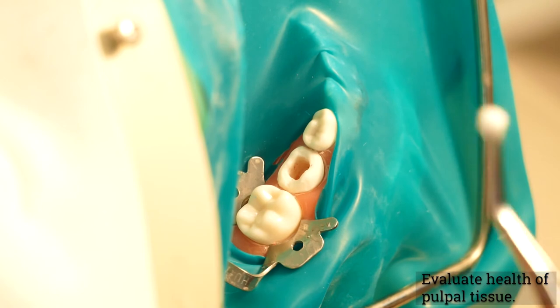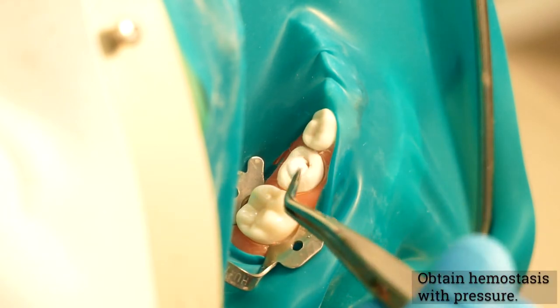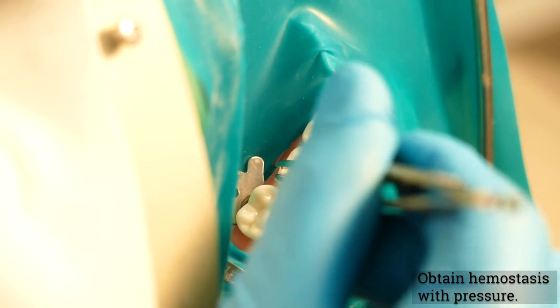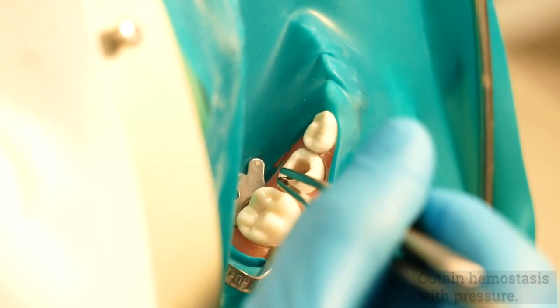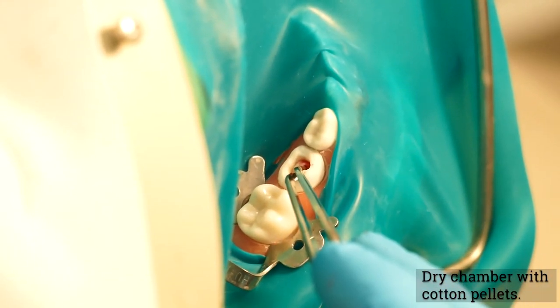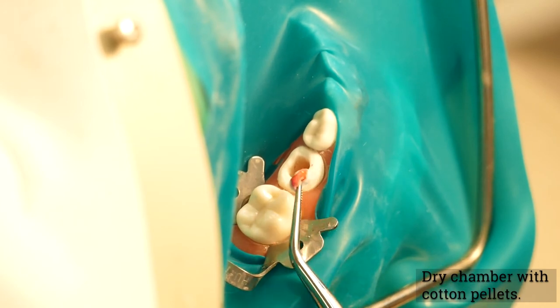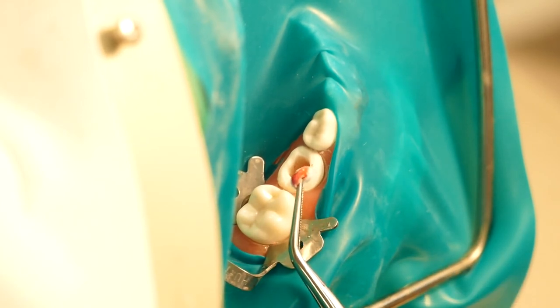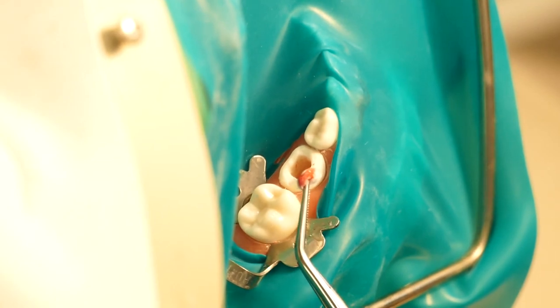Evaluate the health of the pulpal tissue. If there is evidence of hyperemia after removal of the coronal pulp, which indicates that inflammation is present in the tissue beyond the coronal portion of the pulp, this technique should be abandoned in favor of pulpectomy or the removal of the tooth. If the hemorrhage is controlled readily and the pulp stumps appear normal, it may be assumed that the pulp tissue in the canals is normal and it is possible to proceed with the pulpotomy.